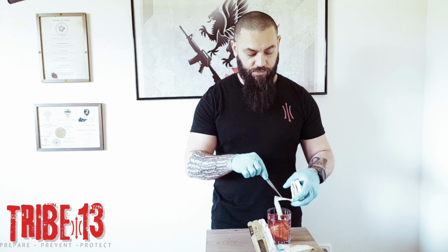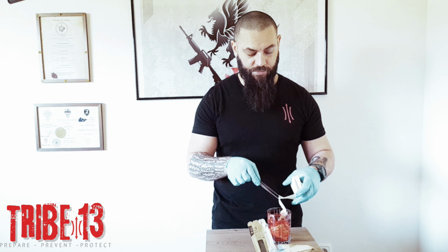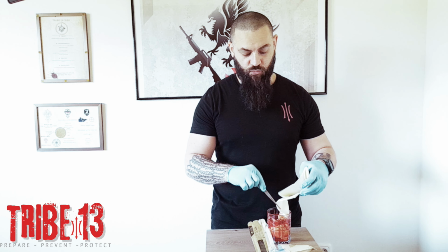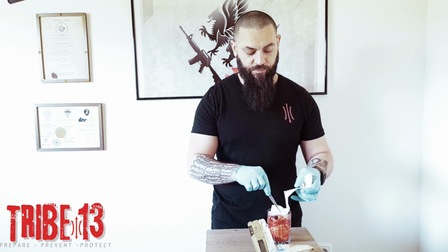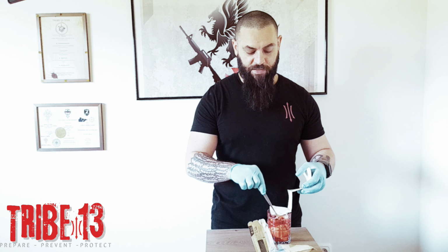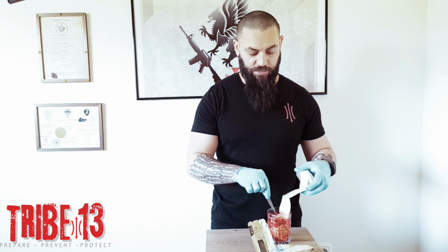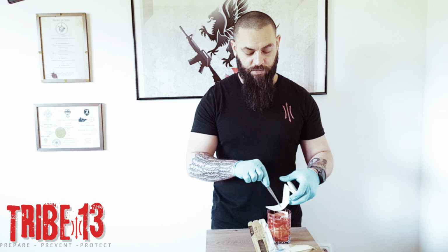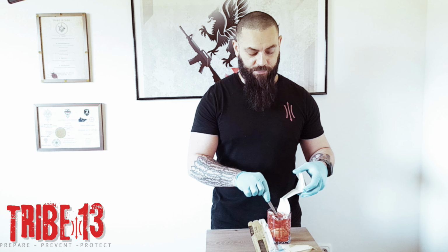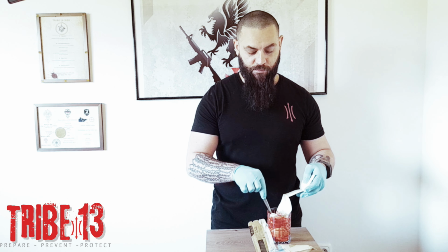I remind you that normally when you make a wound packing, and I have some videos regarding this, after you fill all the cavity and you put the hemostatic gauze directly finding the source of the bleeding, after you also maintain pressure. So basically the hemostatic gauze, it's between 3 and 5 minutes depending also on the product. The normal gauze, you must keep it at least 10 minutes.